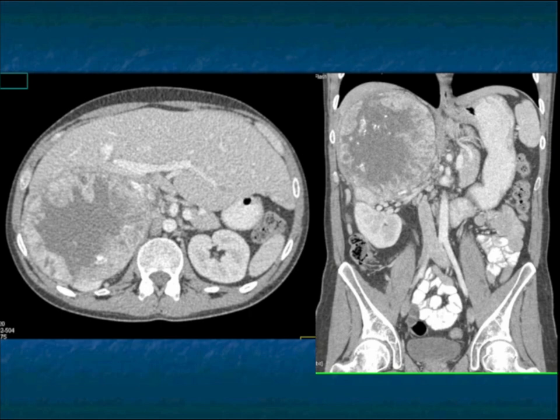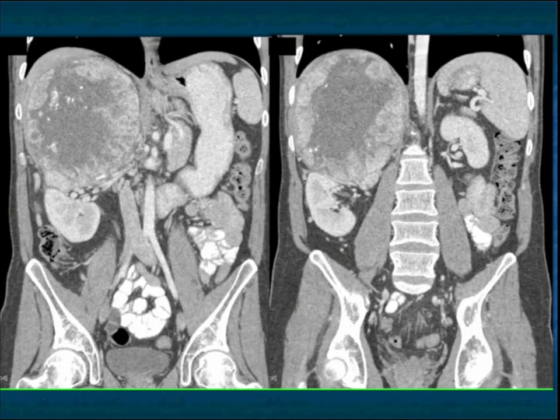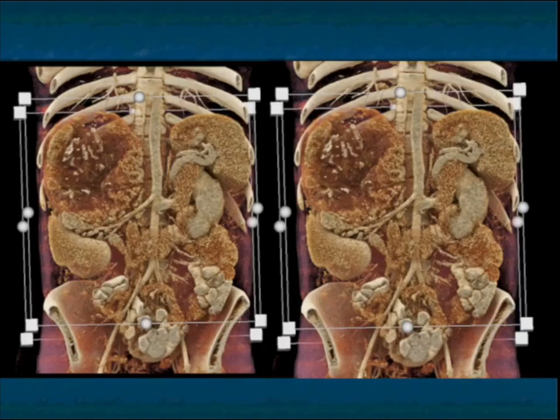Coronal views are especially helpful. And of course, looking at these tumors as well beyond coronal views can be very valuable also. So that becomes very, very important. So it's something we need to look at carefully. And here again, extensive necrosis by the patient's tumor. And again, another set of images. You can see there's no distant nodes, but there are local nodes present. Again, another example showing you the cinematic rendering picture.